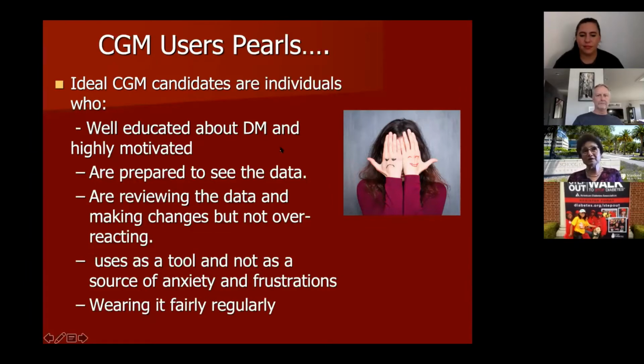Sometimes I panic: if I eat a large fruit, I can see my CGM in the 180s, 190s, and I think, oh my gosh, and I check my finger stick and it's normal, or it correlates with the CGM. But just so you know, individuals without diabetes can spike their blood sugar. That's not something unusual.